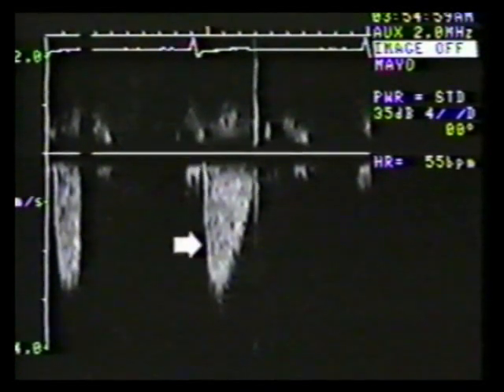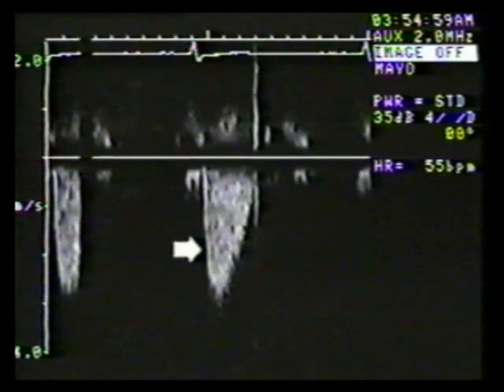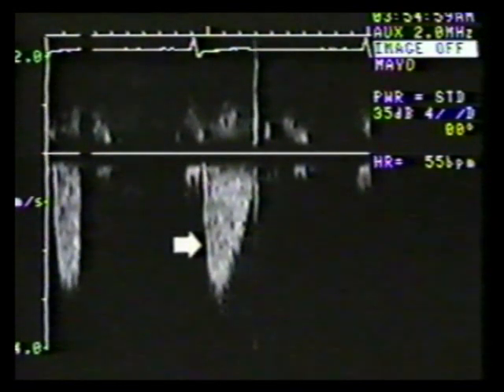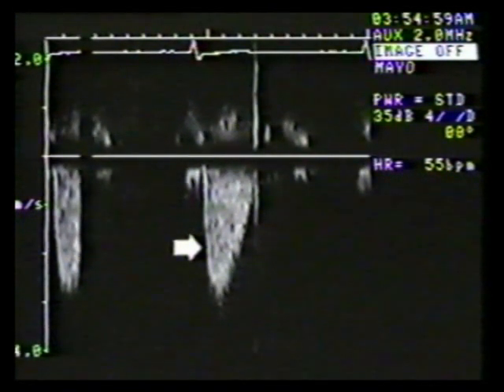This is the CW velocity spectrum across the Carpentier-Edwards aortic prosthesis, for which we have already measured the LVOT diameter and LVOT velocity. For this patient, the maximum velocity spectrum was identified using an apical transducer position. The maximum velocity is 3 meters per second.